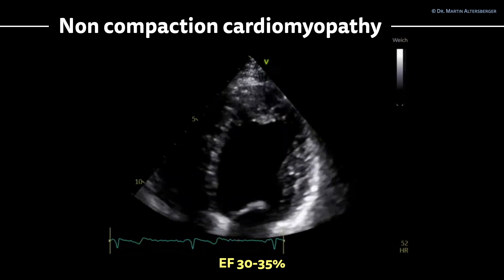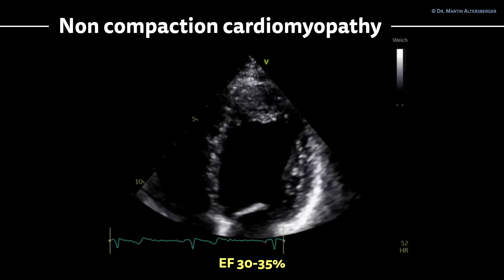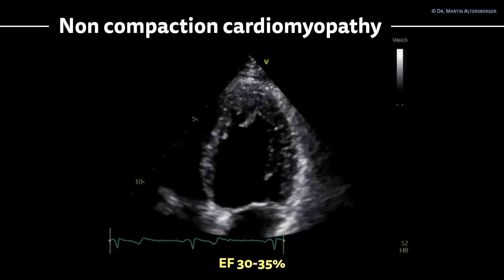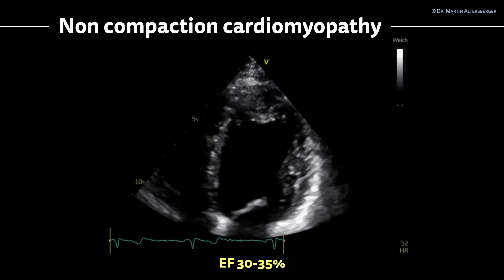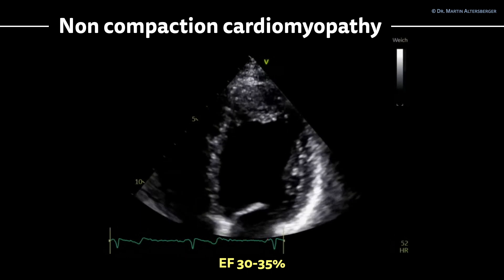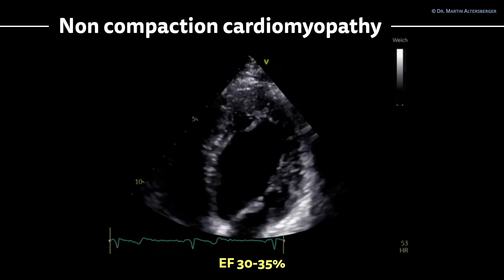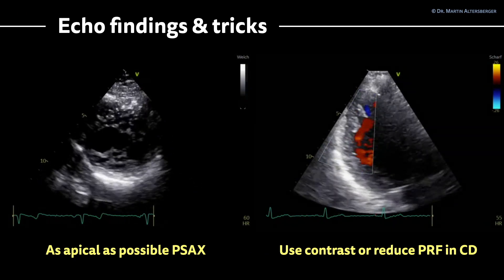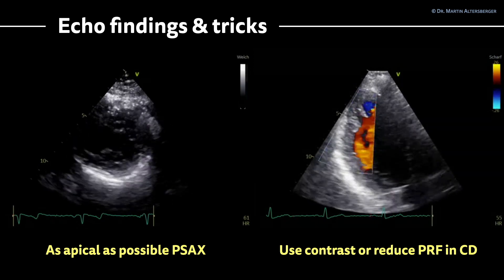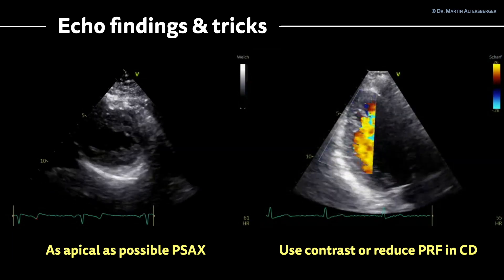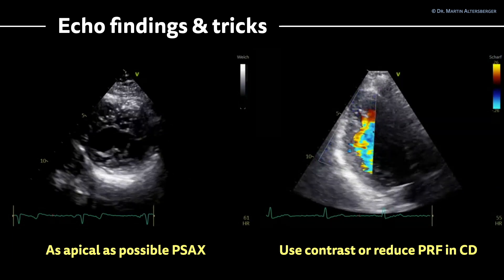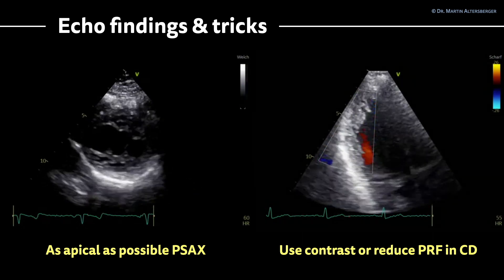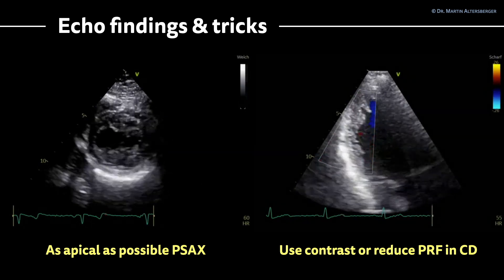In the first follow-up exam, the ejection fraction is probably in the range of 30 to 35 percent. If you look at the apical regions you can see more prominent trabeculations, though it's very hard to see. Using a parasternal short axis view and tilting the transducer further downwards toward the subapical region displays the trabeculations quite nicely and helps differentiate where they are located.